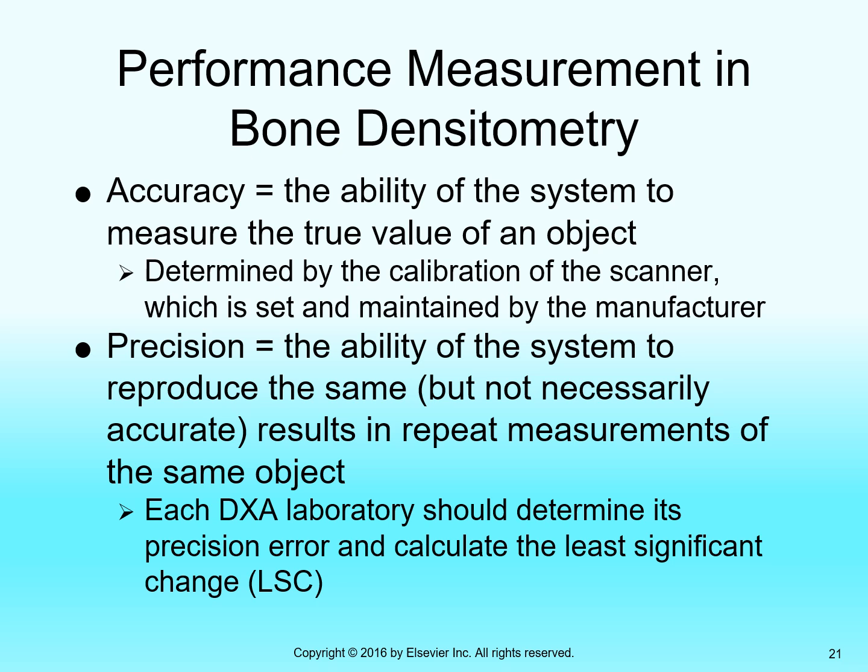So you're accurate there. What's the difference between the two measurements? 0.65 and 0.63 are 2/100ths off each other. That's the difference between their values, 2/100ths. So about 2% variance, okay, on a 100 scale. And that's not even percent CV calculation, okay? It'd be much, much smaller if it was percent CV calculation. But you get the idea.